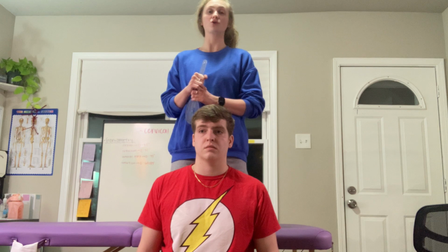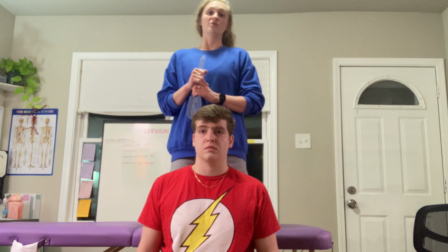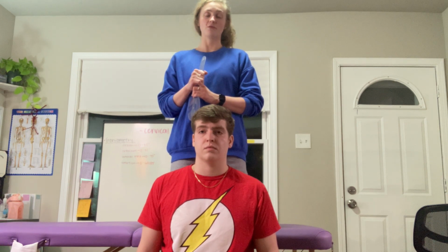All of Nick's values are going to be functional values. However, his lateral side bending to the right and left-hand side are going to be where he's going to need the most work.